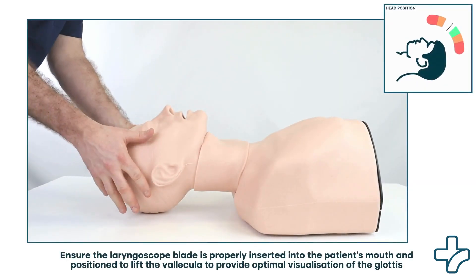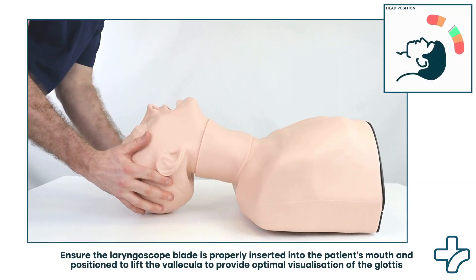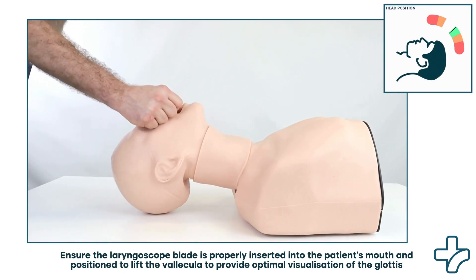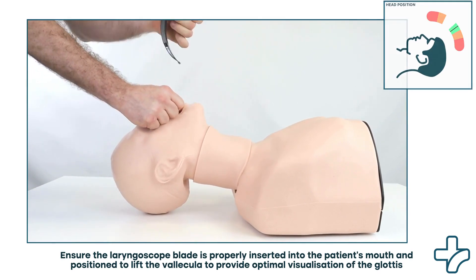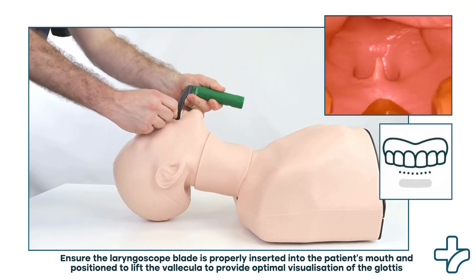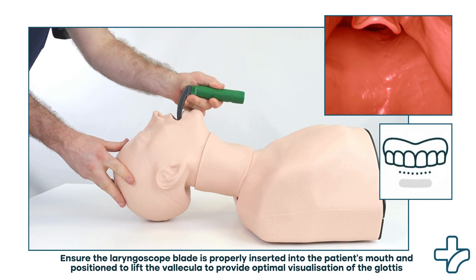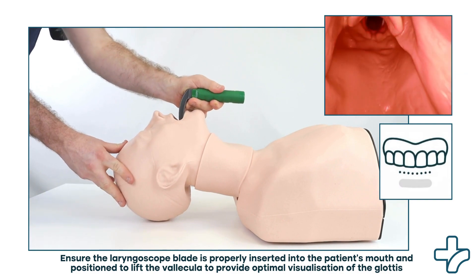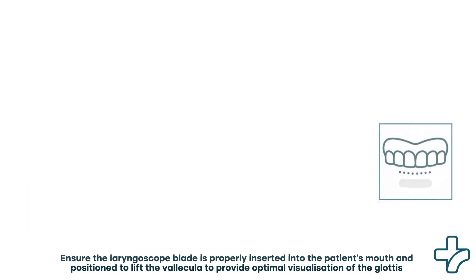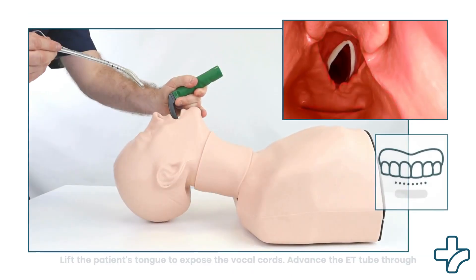Before performing endotracheal intubation, ensure the laryngoscope blade is properly inserted into the patient's mouth and positioned to lift the vallecula to provide optimal visualization of the glottis.